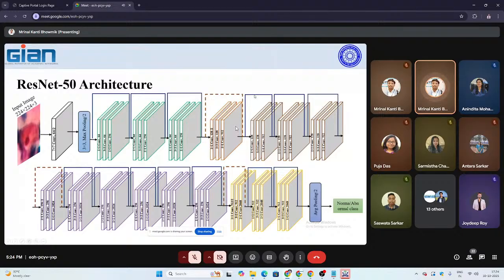Again, perform the identity blocks, 3 identity blocks, then again one convolution block. Then again 5 identity blocks, and one convolution block, and then 2 identity blocks. And here is the average pooling, with stride 2.